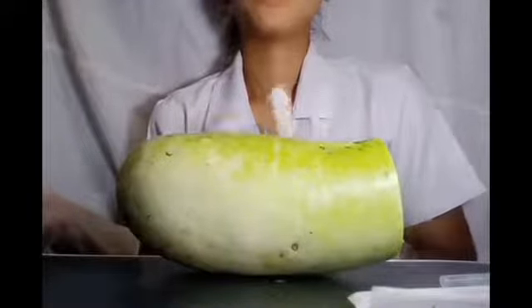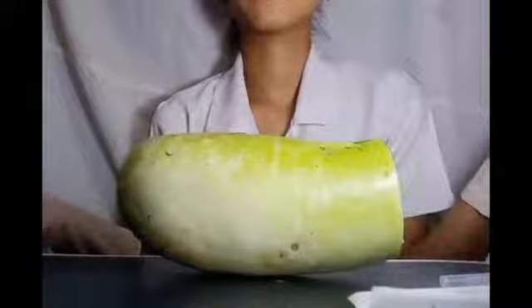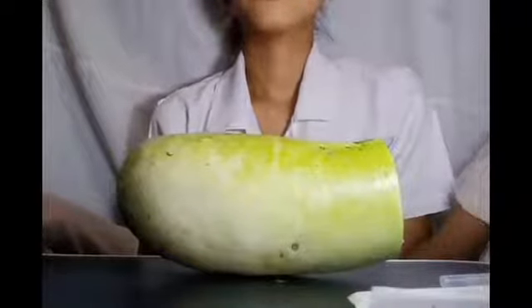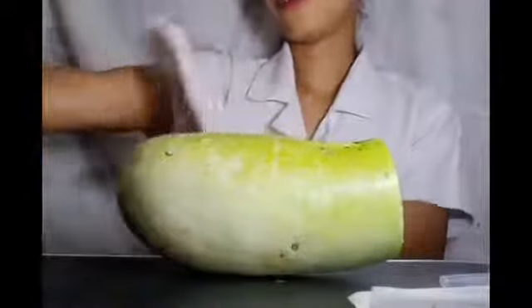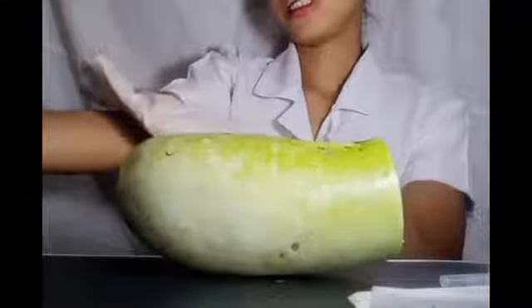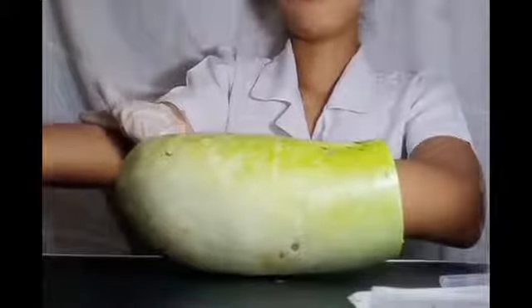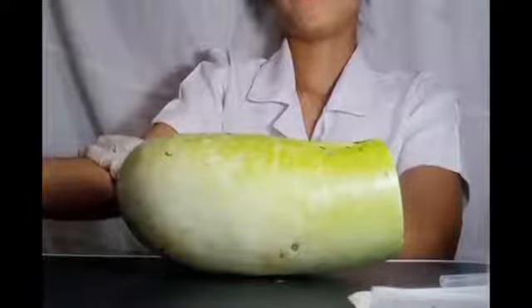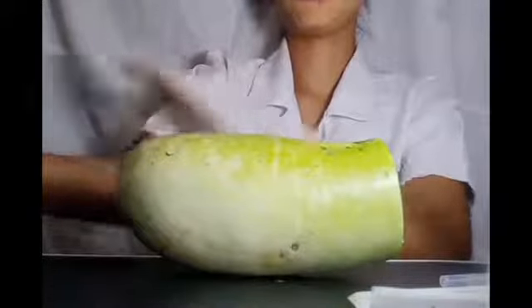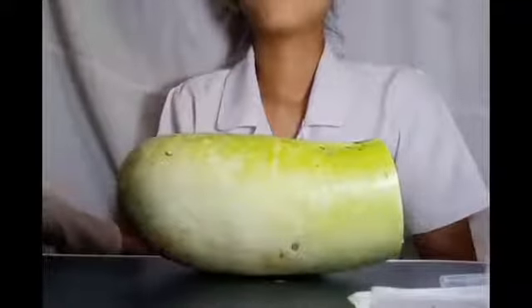For example, this is a forearm. We're going to go from here, 1, 2, 3, 4 fingers down on the forearm, making sure that the patient's arm is flat and resting on a surface like a table.